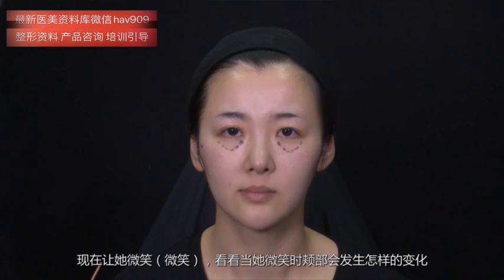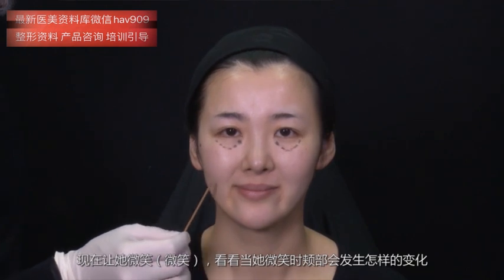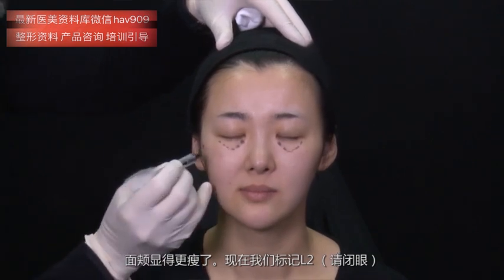And I'll ask her to smile. Smile. Take a look when she smiles. What happens to her cheek? It got slimmer. Now, let's mark the point, close your eyes, L2.